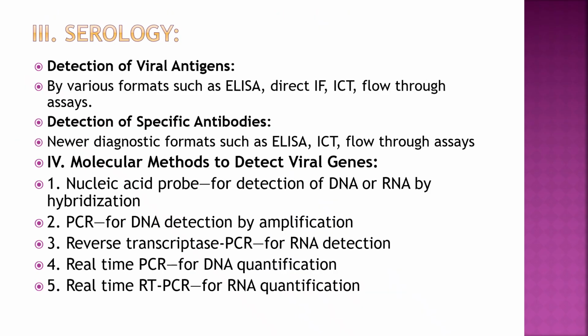What is serological method? Detection of viral antigen by various formats such as ELISA, direct immunofluorescence, immunochromatography, flow through assays. That is seen in HIV. Detection of specific antibodies, your diagnostic formats such as ELISA, immunochromatography, flow through assays.